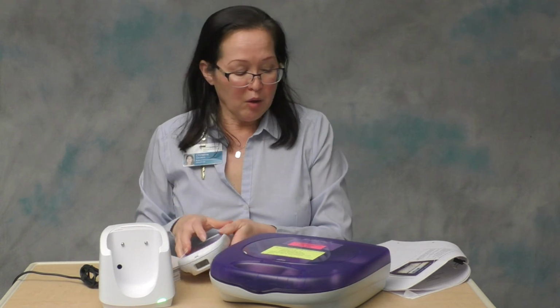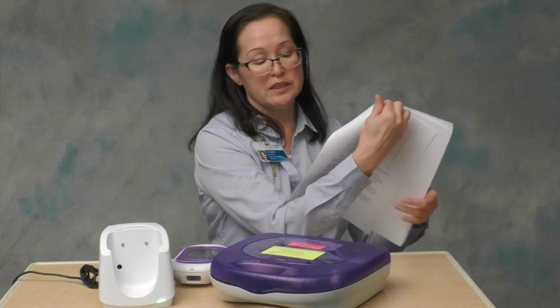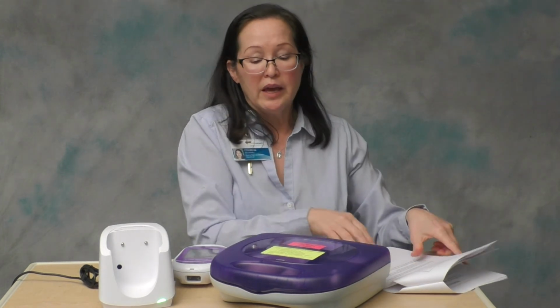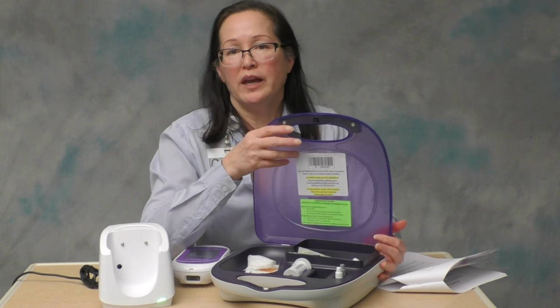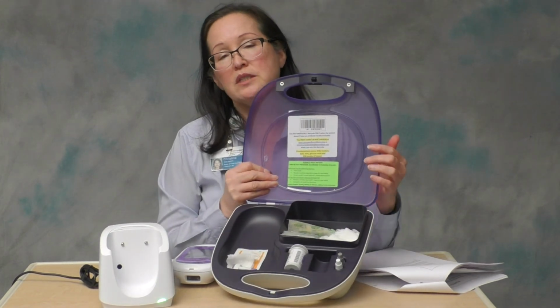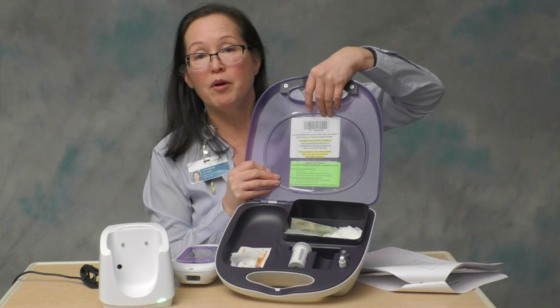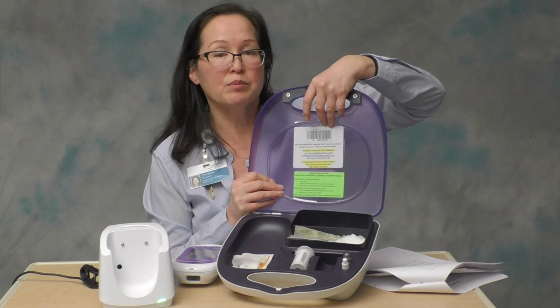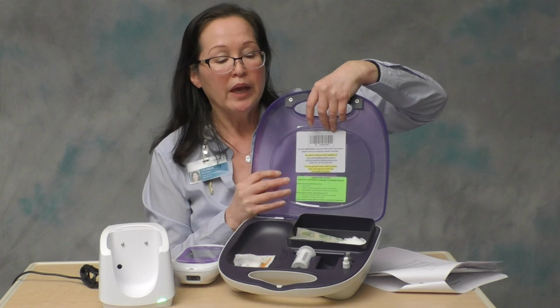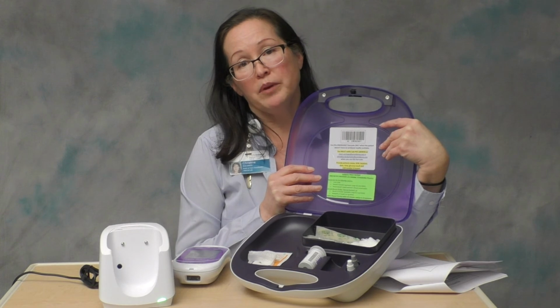Now, we do have a mechanism that will allow you to run a patient test in case a patient has an unscannable armband. It may be wet, it may be smeared, they may be in surgery with their arms tucked and draped and you can't access the armband. So inside the lid of the meter tote, we have what we call the emergency barcode. You can scan this barcode and it will give you access to perform a patient test on the meter.